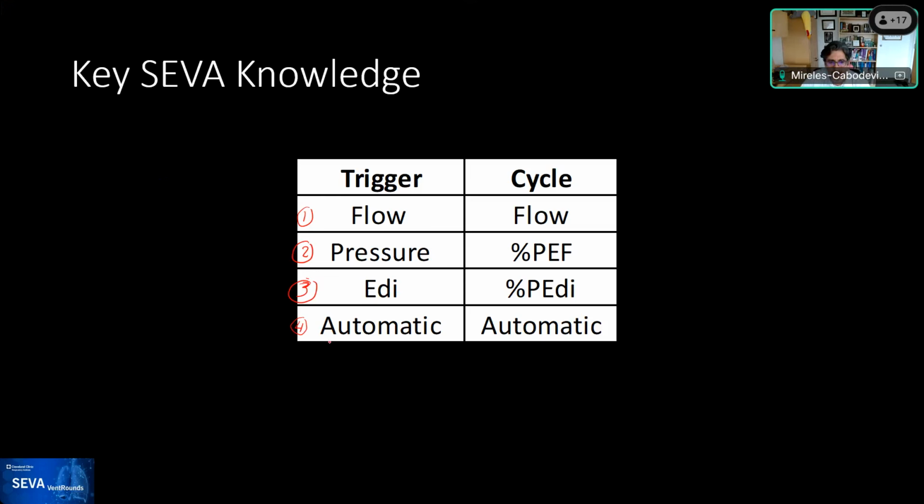So some ventilators have some level of intelligence and rules that they are analyzing the waveforms, and then they will trigger the breath based on deformations that occur on the waveform, on the pressure or the flow waveform. And so I put it here as automatic, but that's why I said Rob may have a better way of calling them. And this one is currently one of the interactions, and the one that you're going to see today is the IntelliSync on the Hamilton ventilators. Rob, comments about this? Go ahead.